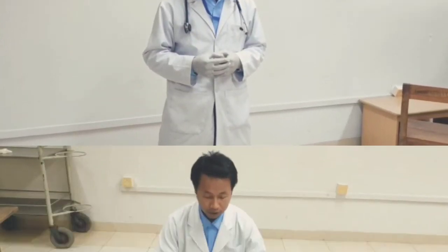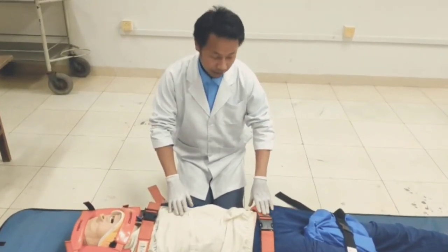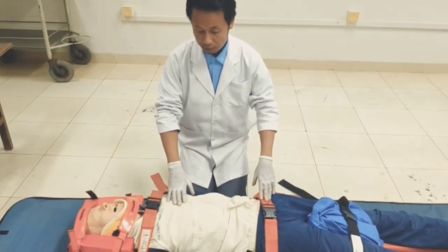After stabilizing the patient on the spinal board, we have to perform an appropriate secondary assessment and obtain vital signs and SAMPLE history. We also have to manage secondary injuries and communicate with medical direction. And we should not forget to document all the information obtained while doing patient assessment. After reassessing the PMS, the patient's PMS is not compromised, so we can shift the patient to the ambulance for transportation.